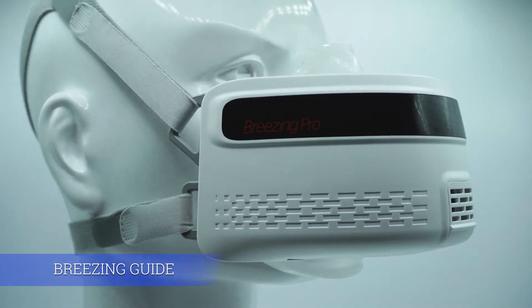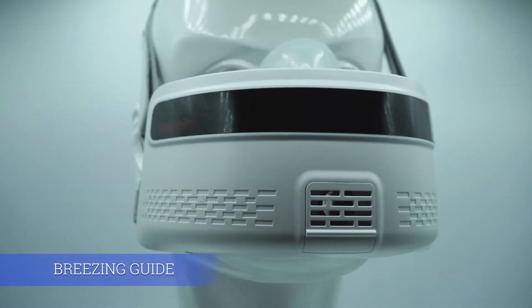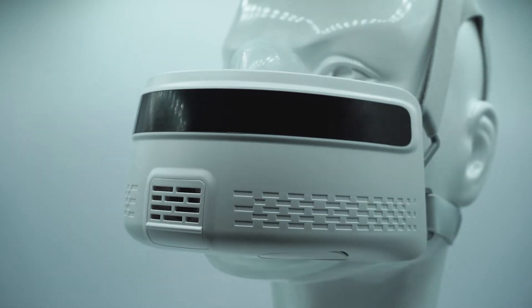Welcome to the Breezing Guide. You'll learn to measure a patient with the Breezing App and Breezing Wearable Metabolic Analyzer.